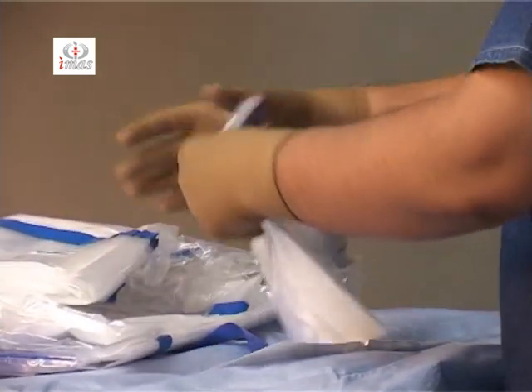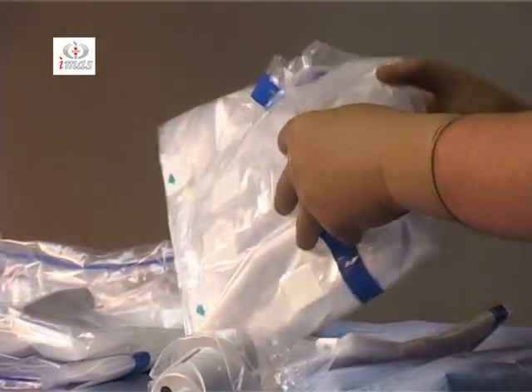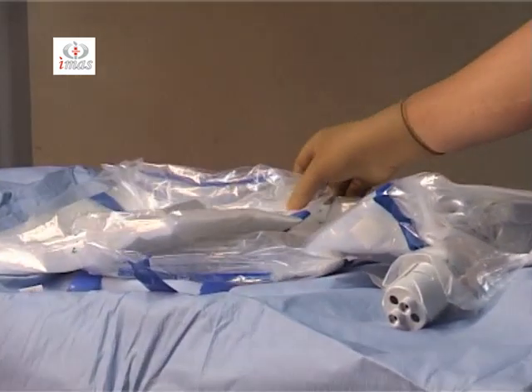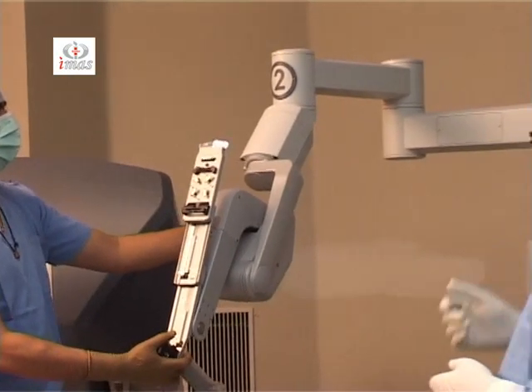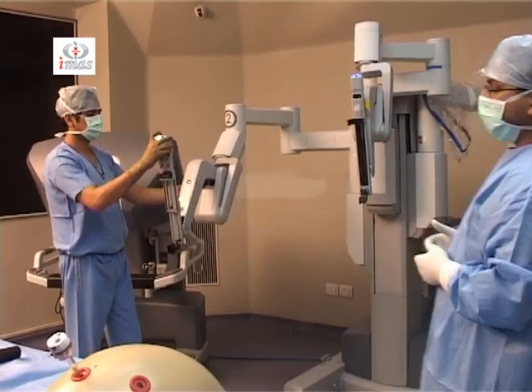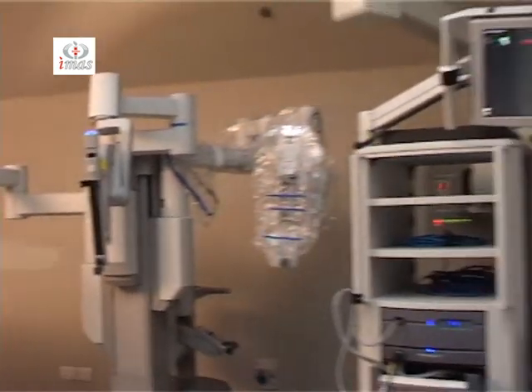There is one camera drape in order to drape the camera head, one camera arm drape, and two instrument arm drapes in order to drape the instrument arms. This is an instrument arm drape. You have to open the arm by pressing the port clutch and the clutch buttons and splay the arm and take it to your optimum height, and then you take the instrument arm cover from the sterile trolley.